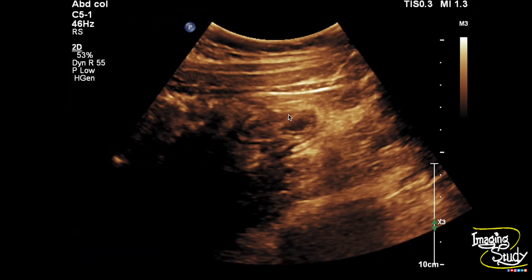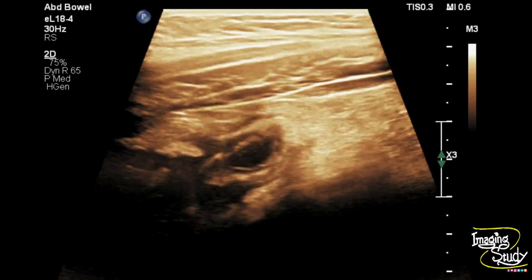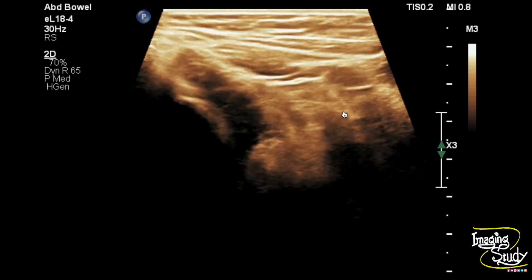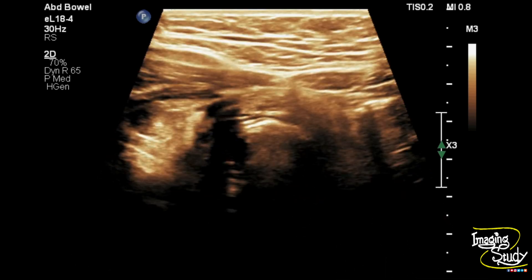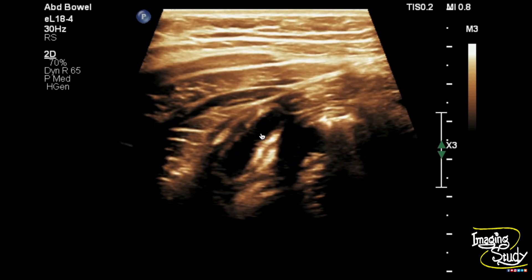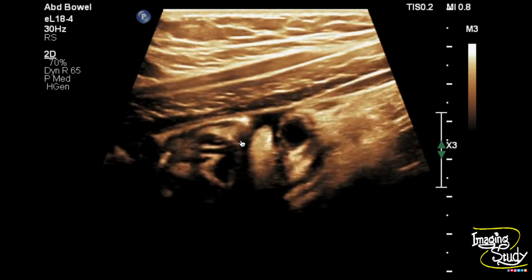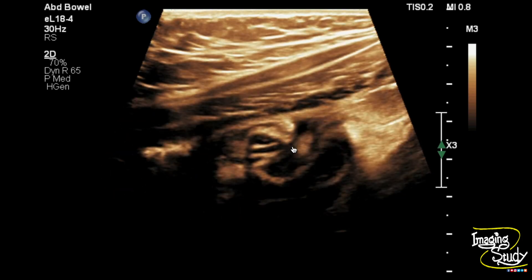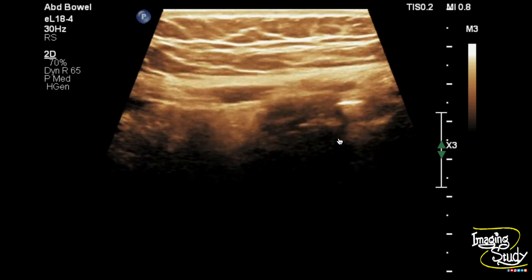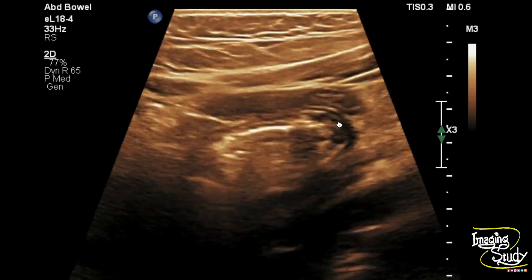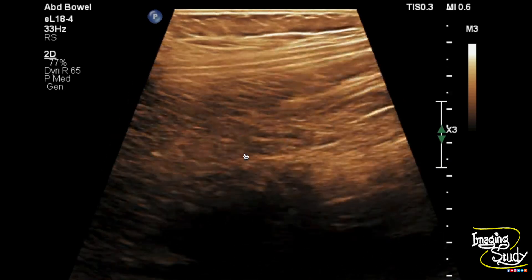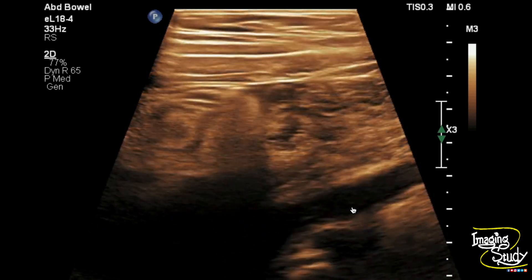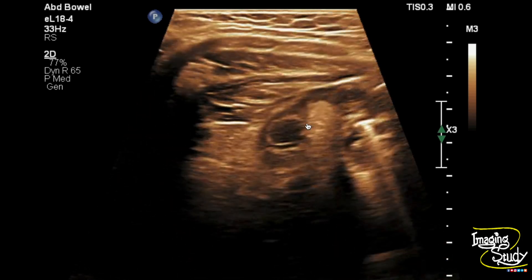Here is the picture we'll see now with the linear transducer. Here is the linear transducer view with high frequency, and you can see a tubular dilated structure at the right iliac fossa with surrounding echogenic fat stranding. You can see some anechoic collection adjacent to this structure, which indicates peri-appendiceal collection. This blind-ended tubular structure is showing the presence of gut signature — you can see multiple layered walls, which indicates gut signature.